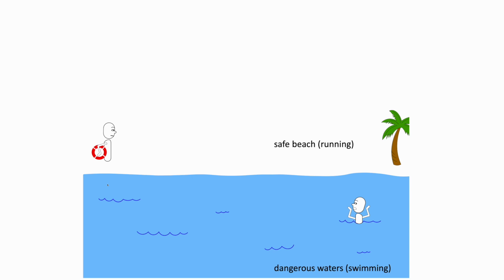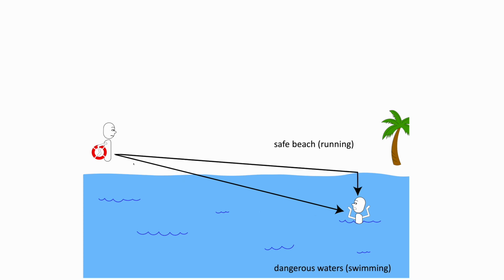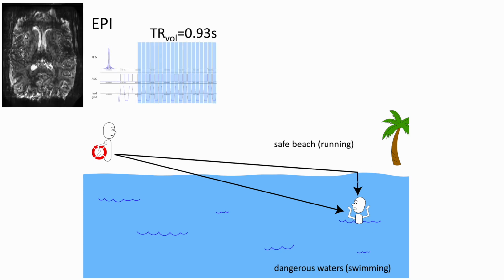motivate the kind of thinking about segmentation with this lifeguard metaphor, where we have the lifeguard who needs to serve the person in distress, and the direct way to rush there would be the Euclidean distance, the shortest, but then the lifeguard spends a lot of time in dangerous waters, and the lifeguard is not as fast in these waters, right? And maybe it would be more efficient to spend as much time on the beach and then be in the water as little as possible.